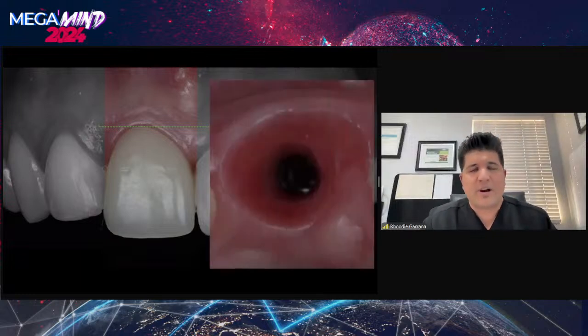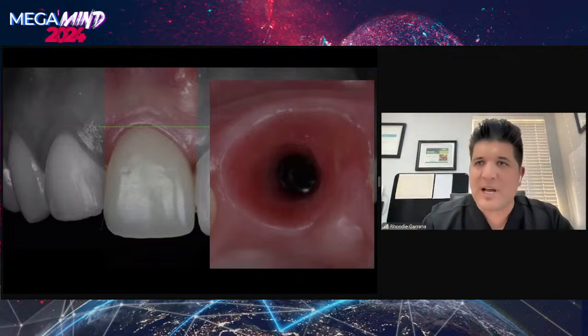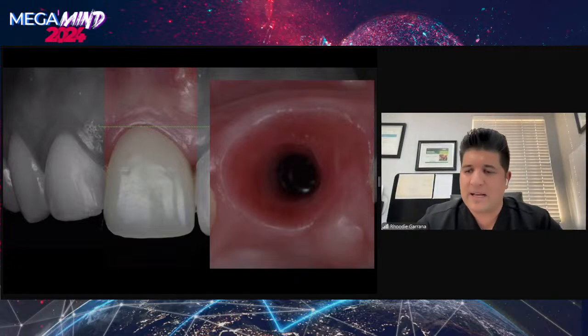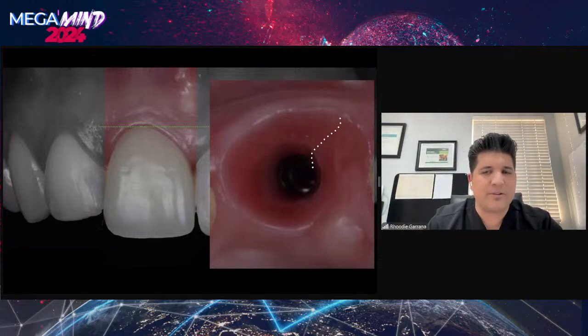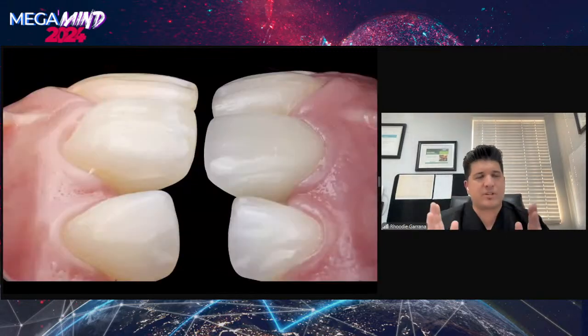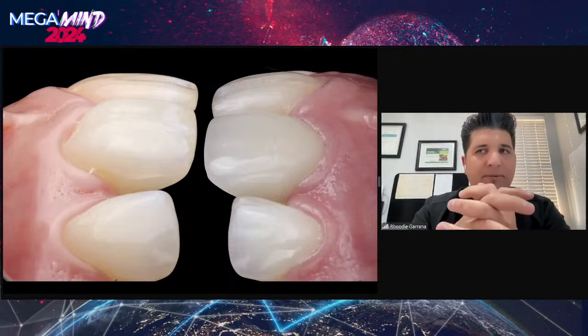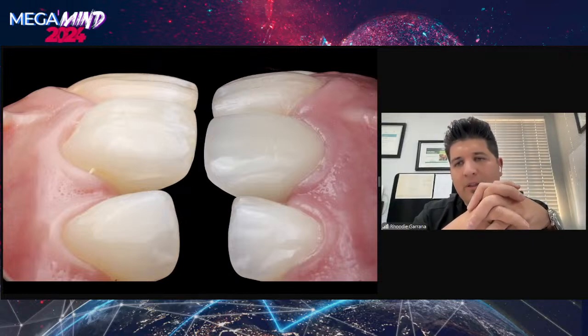Once removing that crown, one can argue, should we be removing crowns and replacing crowns on and off all the time, breaking hemidesmosomal attachment? Potentially not. However, I did remove the crown at this point, and we can see a beautiful S-line curve. And we can see the soft tissue filling in that S-line curve very, very nicely. And so this is just a mirrored image showing the case on your left-hand side before, and a mirror of the implant crown on the right.